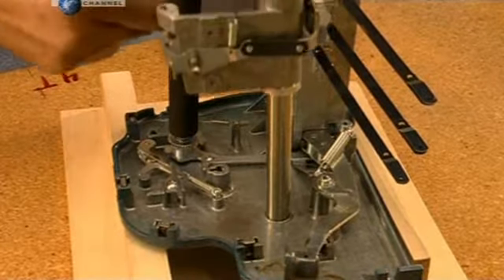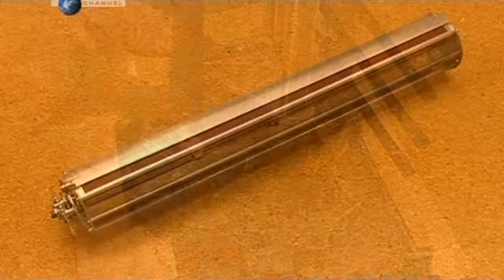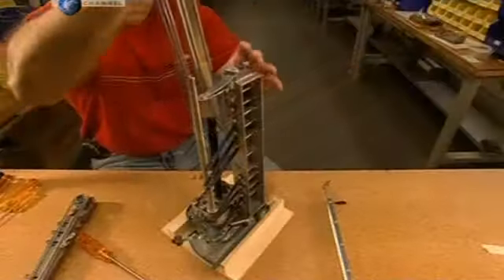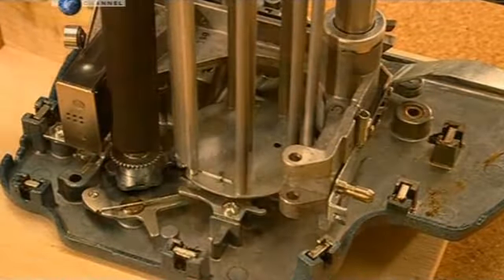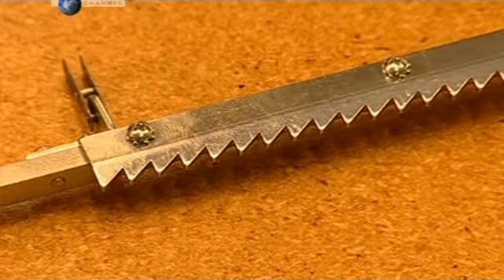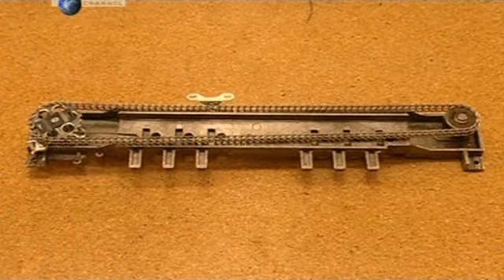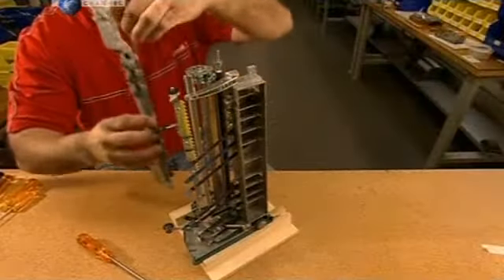The carriage is slid onto the carriage tube. Next, the drum is installed. The feed tube transfers the paper to the drum. The drum winds it into the machine, positioning it for typing. Then the rack bar. Each tooth in it is the width of a Braille cell, ensuring the carriage advances the correct distance between letters. The chain assembly which advances the carriage is installed.